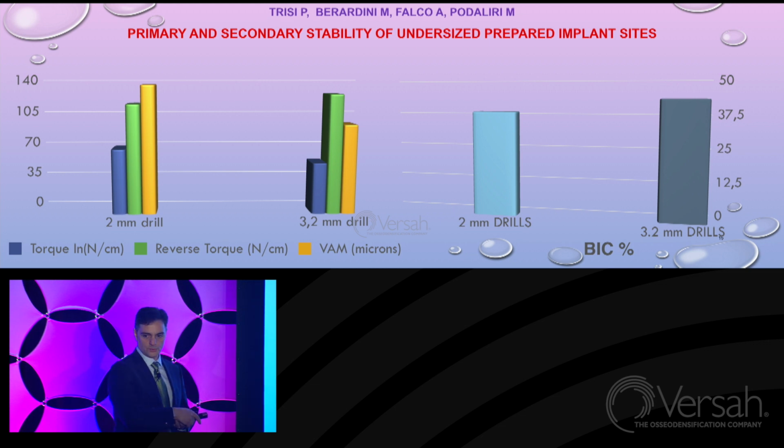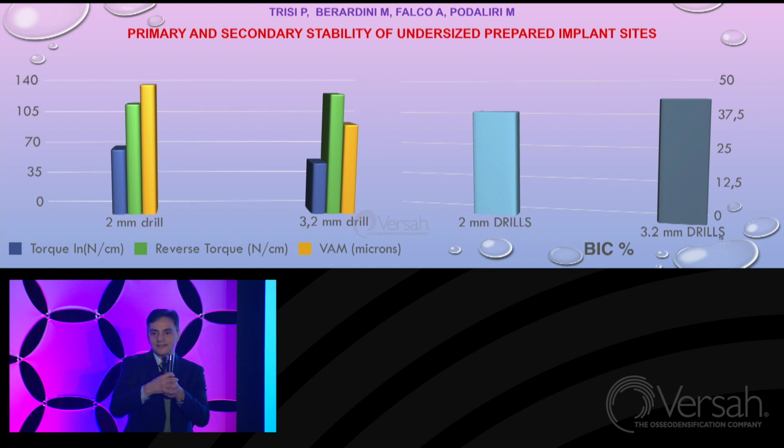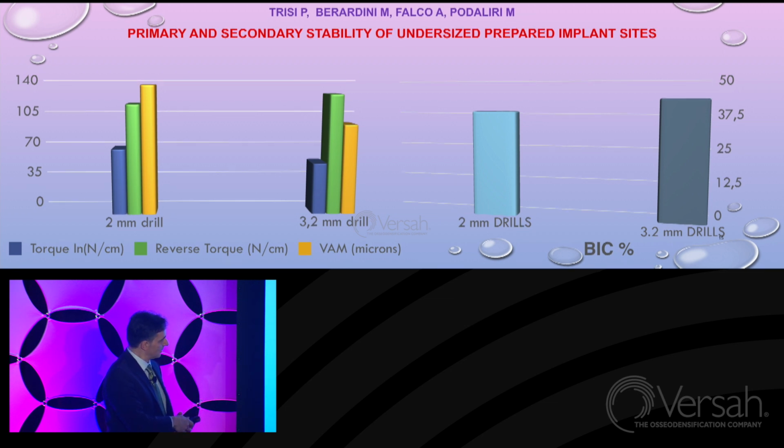We increased the insertion torque. There is some relationship between insertion torque and primary stability. The reverse torque, again, is a measure of the strength between the implant and the bone. So if we need more torque to unscrew, it means that the implant is more connected to the bone after 2 months of healing. But the lateral displacement tells us that the implant is moving. And for the implant placed with the 2 millimeter hole, the displacement was much higher than for the implant placed in a normal preparation site.